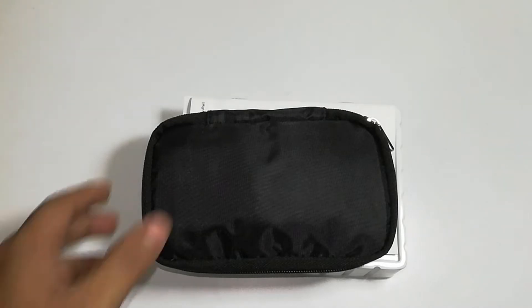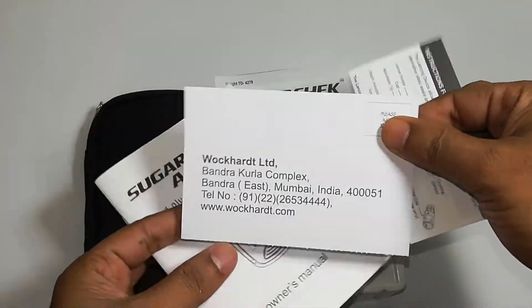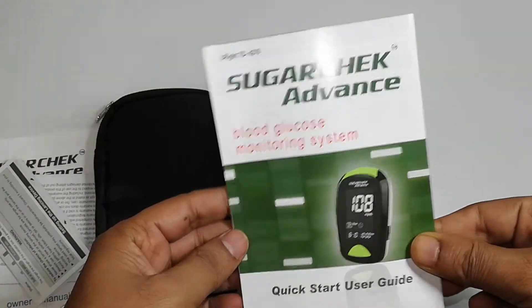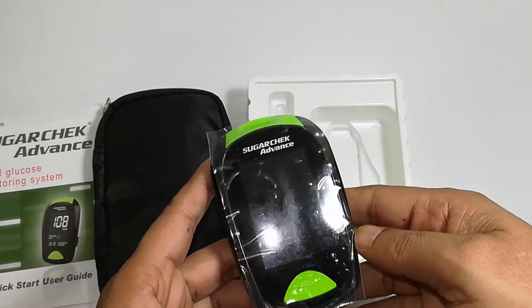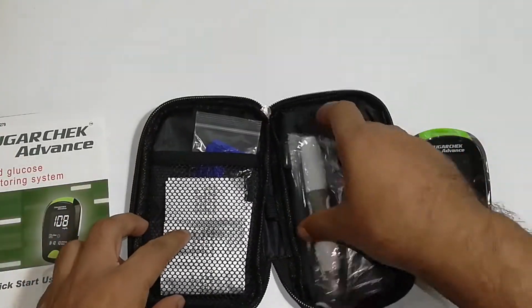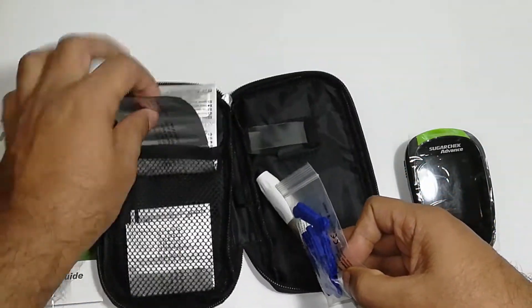Opening the box, we have a pouch and then manuals. This one seems to be the warranty card, and one more quick start guide. Inside the box we have the actual machine. The machine has to be set up, and then we have a separate box for the pouch, which contains the ejecting lancet pen.